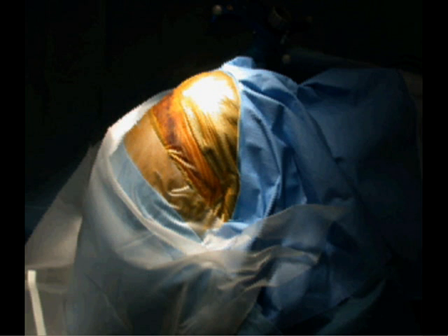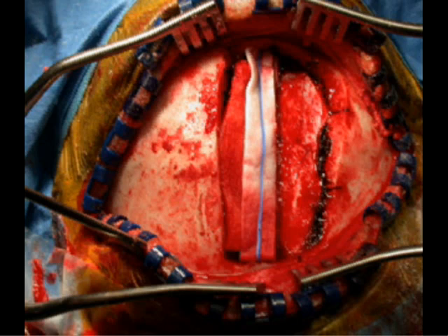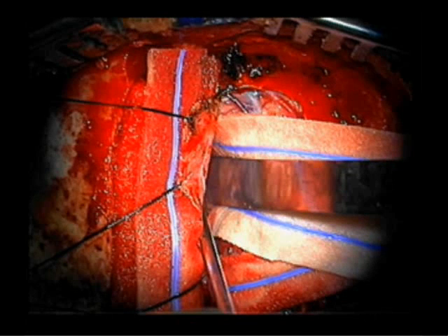After minimal clipping of the hair, a sigmoid incision located over the coronal suture is used. A 4 by 8 cm craniotomy is fashioned across the midline after placement of 3 to 6 burr holes for dural stripping.